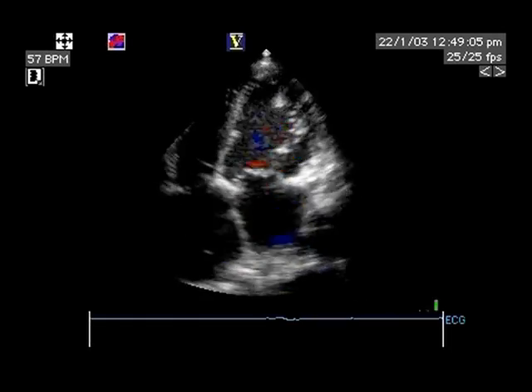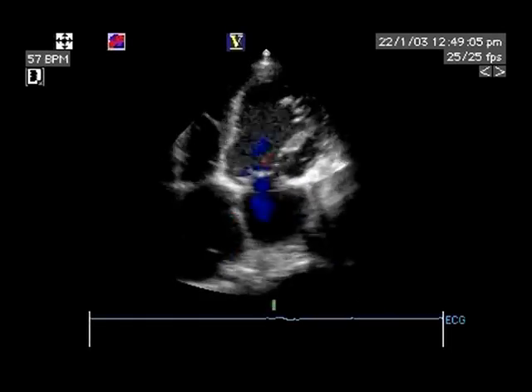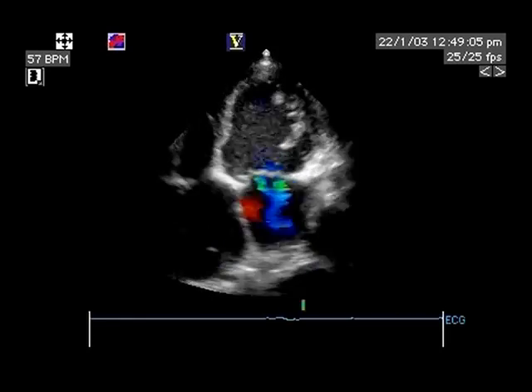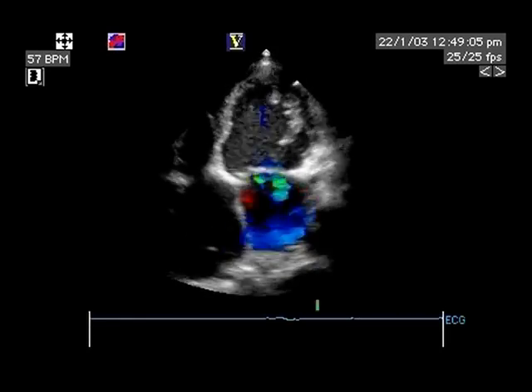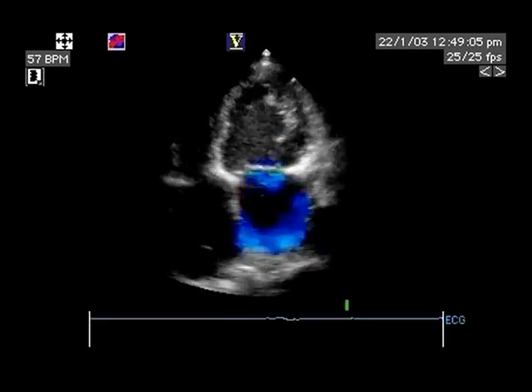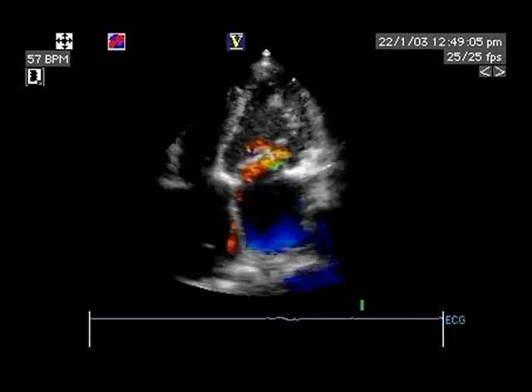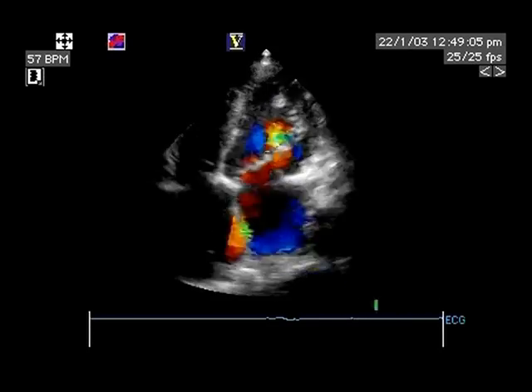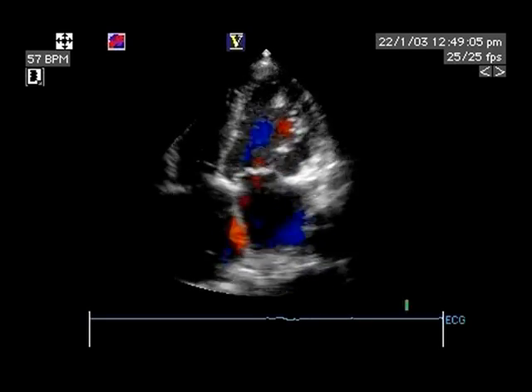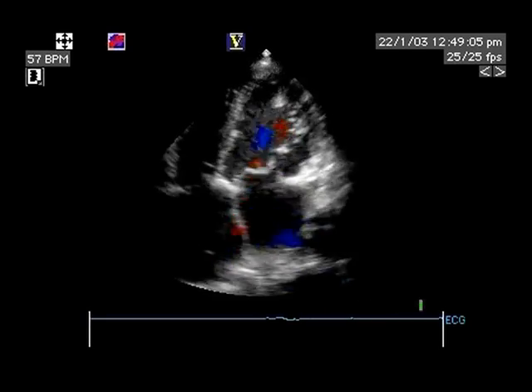Apical four-chamber view demonstrating globular or spherical remodeling of the left ventricular cavity. The left atrium is dilated as well. The lateral wall contracts normally, and the septum in its inferior portion is akinetic. There is mitral valve tenting and mitral insufficiency of mild to moderate severity.